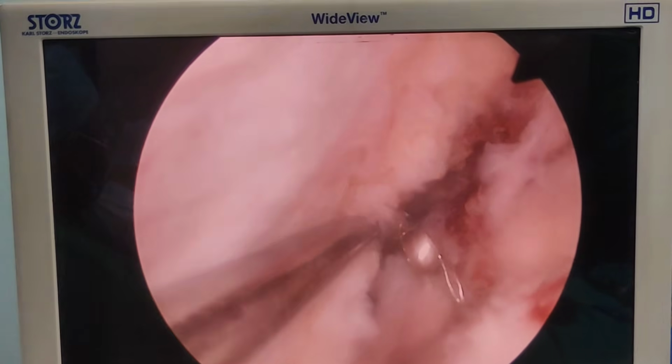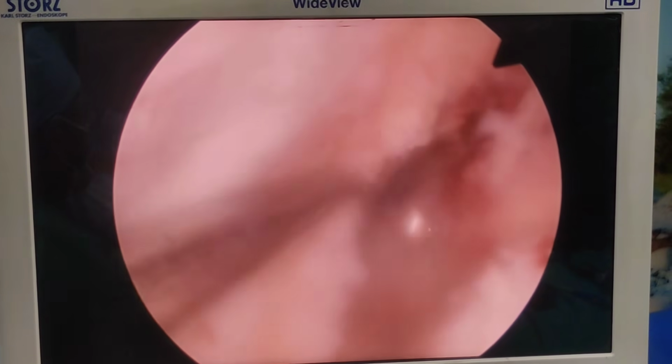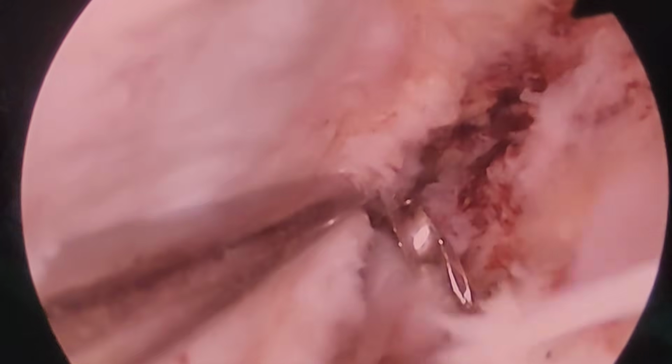So now I've just got this curette. I was struggling to put a curette through the anteromedial portal, so I've got this straight curette. You have both options. You can go through the anteromedial portal, where you have this curved curette which you put. I have got a straight curette and I'm just going through the posterior medial portal. My camera is also there, but I've taken my cannula out. So we'll drill it.